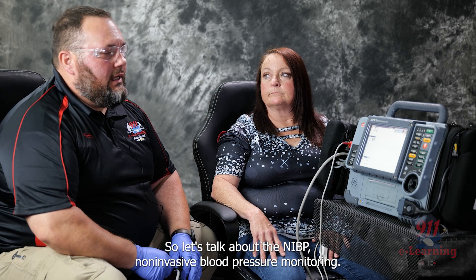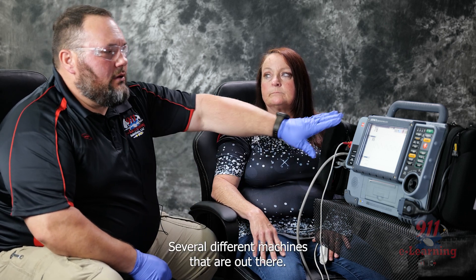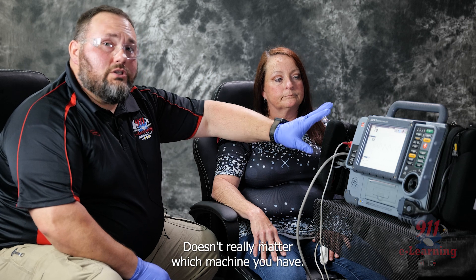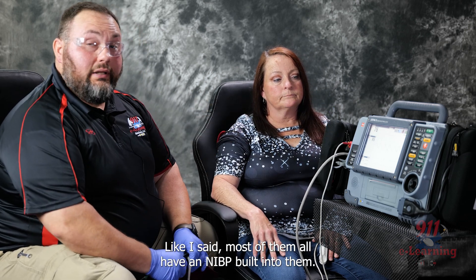Let's talk about the NIBP, Non-Invasive Blood Pressure Monitoring. There are several different machines out there, but the ones we'll see in the field most of the time are going to be built into your monitors. This is a LifePak 15 — it doesn't really matter which machine you have, most of them all have an NIBP built into them.